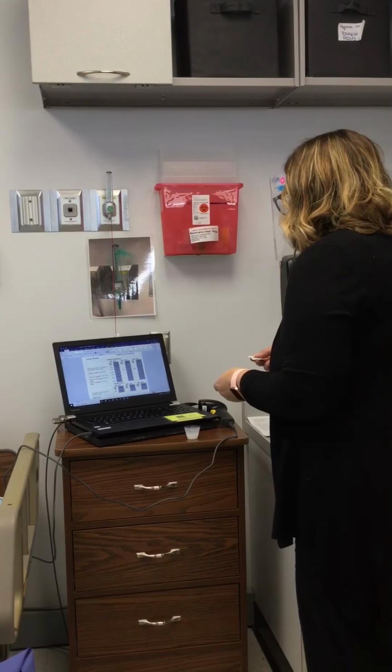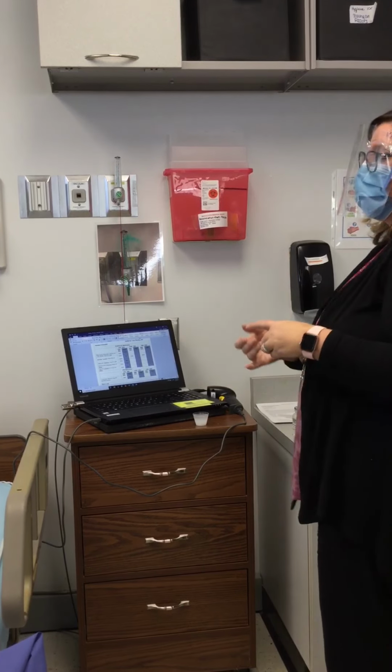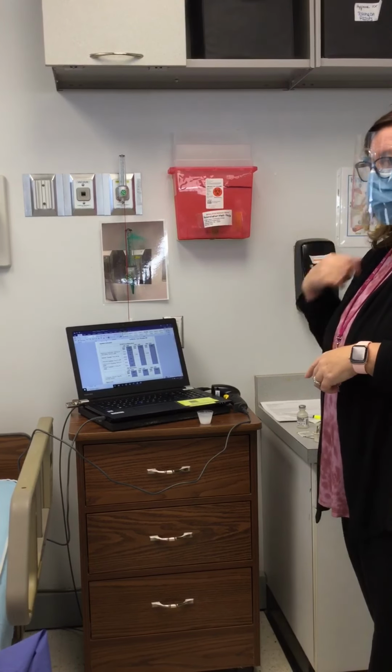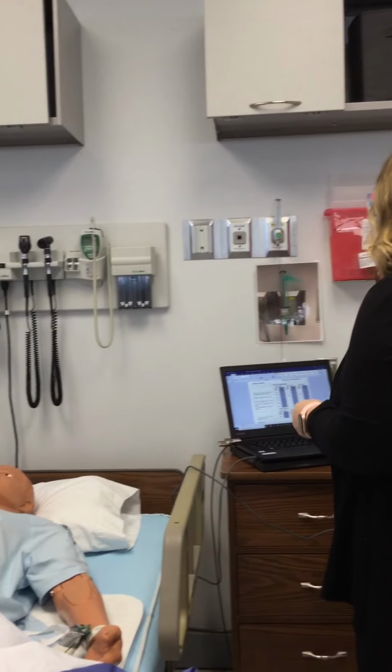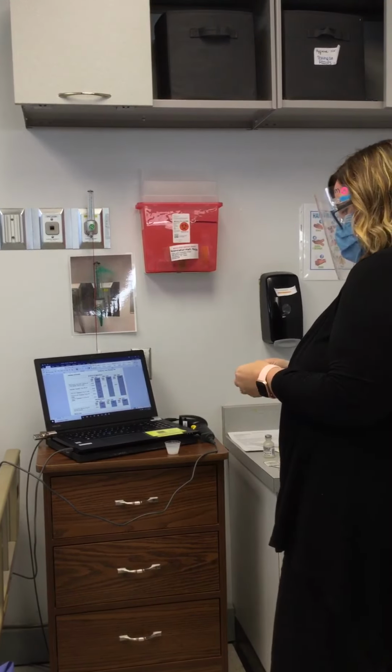I have their digoxin for them, and digoxin is an antiarrhythmic, so I do have to know that I'm going to check the apical pulse for a full minute, have my stethoscope with me, and you're going to demonstrate the placement of your stethoscope on the mannequin at the left mid-clavicular 5th intercostal space, and you have to know the landmarks. And if you have a dig level that's available, you can mention that as well, but you're not going to have that for every patient. So I'm going to put that in there.